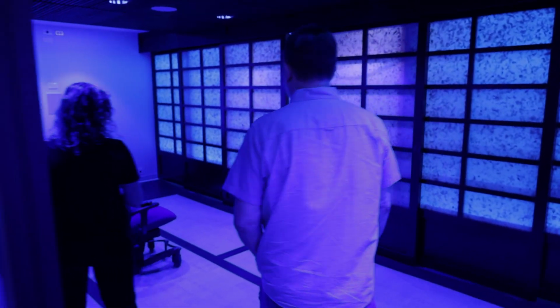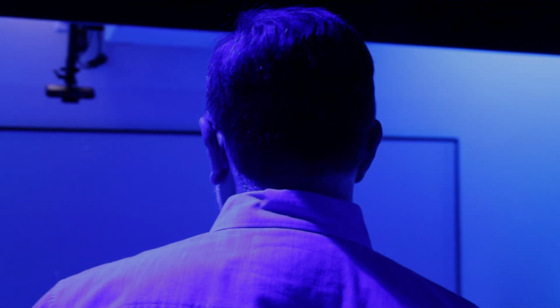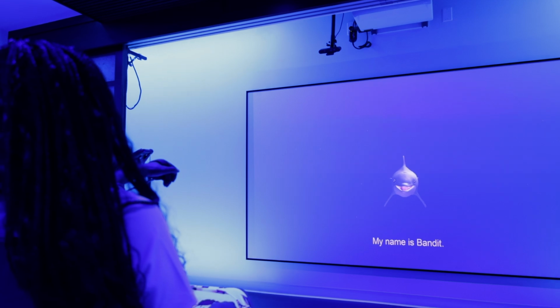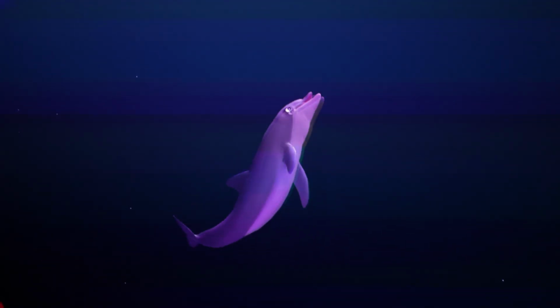We wanted this to be as far from a clinical room as possible. We wanted patients to walk in and not at all feel like they were in a hospital room or a clinic room. This video game is more than just a video game. It's really an interactive experience that's coupled with a trained clinician that really helps motivate the patient, but also attempt to focus on this high repetition of quality of movement in a 3D space.